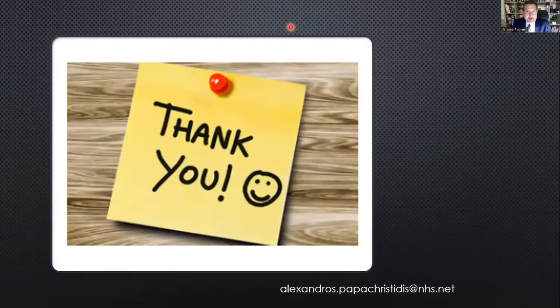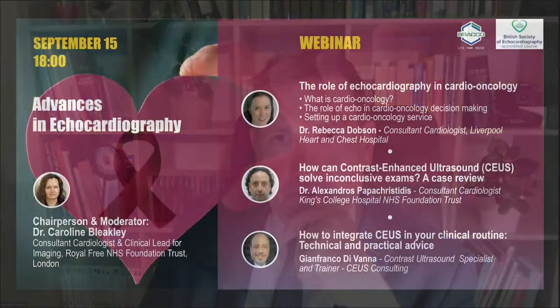Thank you very much, Alexandros, for sharing this impressive collection of cases. I think you showed very nicely how useful contrast can be in solving inconclusive examinations, and you also insisted on the importance of physics and the importance of equipment settings.